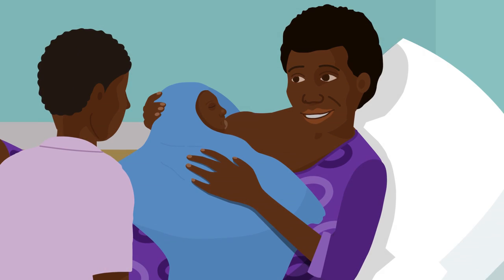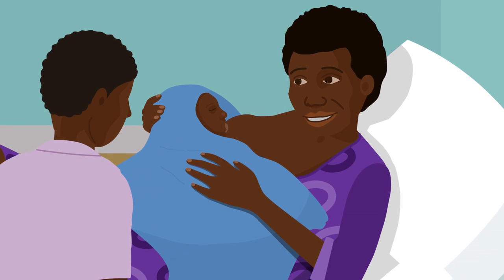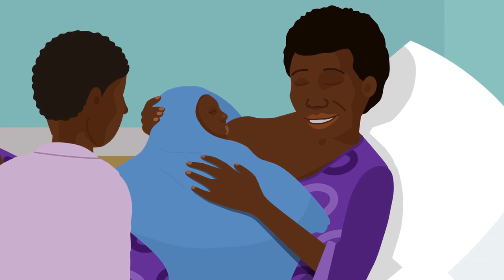In most cases, the UBT will successfully stop the bleeding. Mary and her baby are safe and healthy.